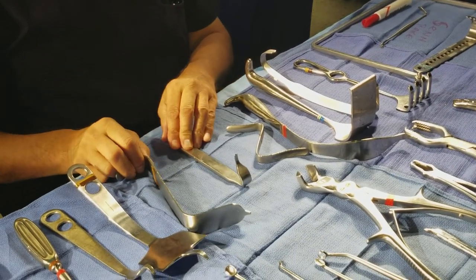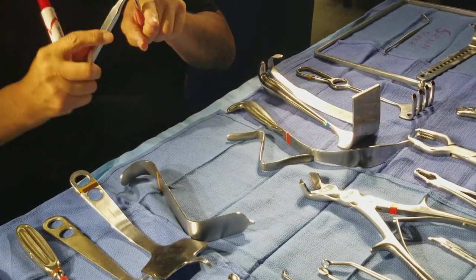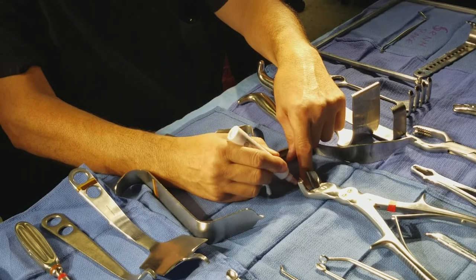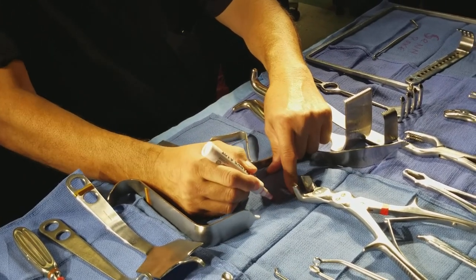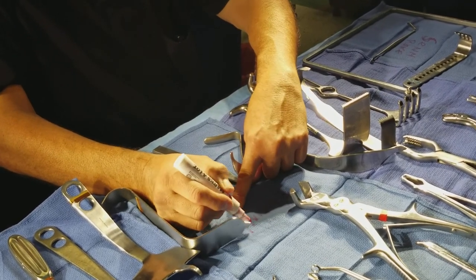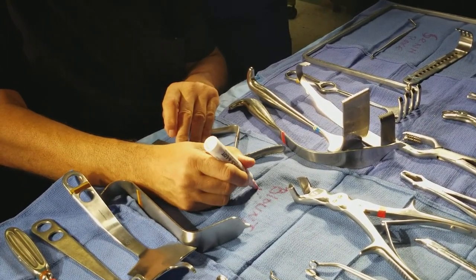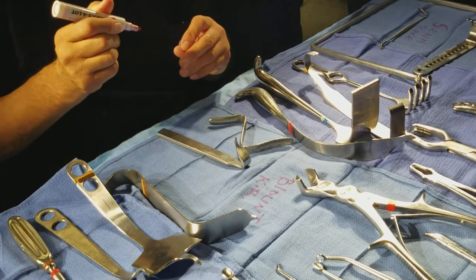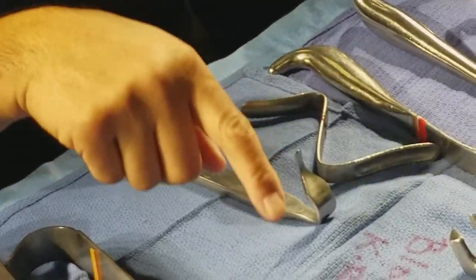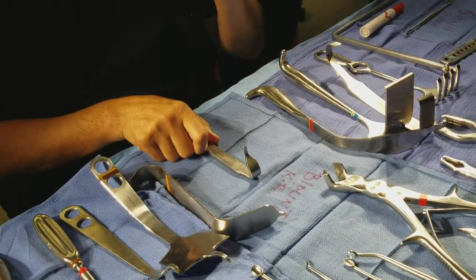Now here are two we have not gone over. This one works like this — you stick it on the side of the knee to retract the ligaments back. It's called a blunt knee retractor — B-L-O-U-N-T — same concept as the Z-knee. That means knee retractor. Blunt knee retractor.